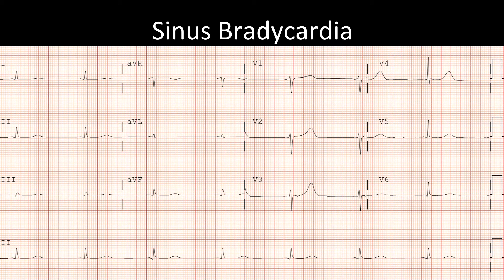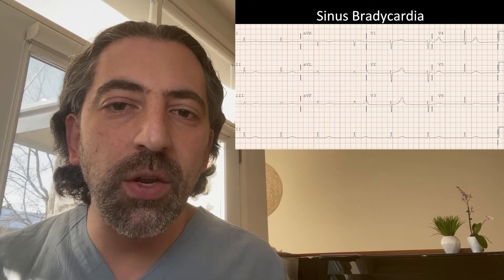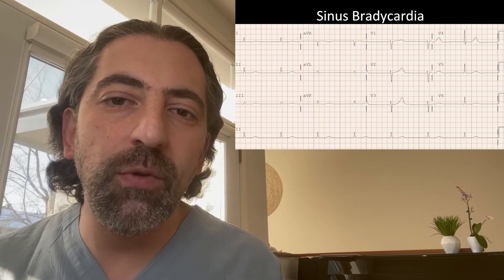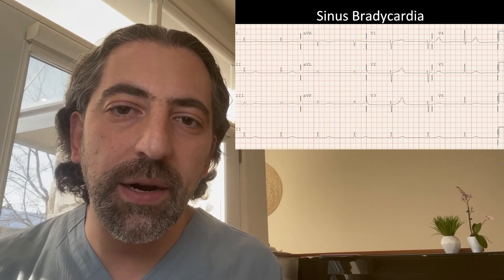In this particular ECG, we see that the P-wave is positive in leads 1 and 2, so it's originating from the sinus node. There is a P-wave before every QRS and a QRS after every P-wave, so conduction is maintained. However, the rate of the P-waves and the QRSs is 43 beats per minute, so this is sinus bradycardia.